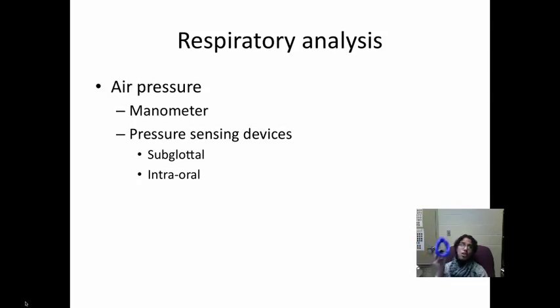Okay. So what this instrument does is it actually measures the subglottal pressure indirectly, by measuring the intraoral pressure at the level of the mouth. This tube is actually measuring your intraoral pressure. Now, for example, in the sound P, when we do P, everything else is closed, right? There is no other pressure, and the pressure that is built at the level of the subglottis is the pressure that should be measured at the level of intraoral. So that's one of the reasons we use that sound as well. So that is an indirect measure of the subglottic pressure.